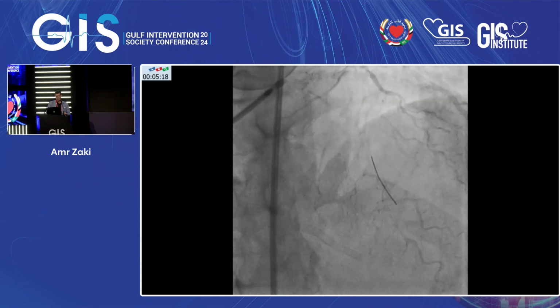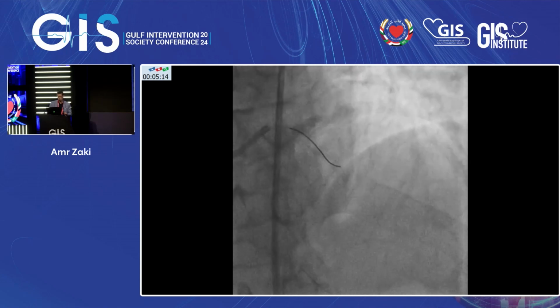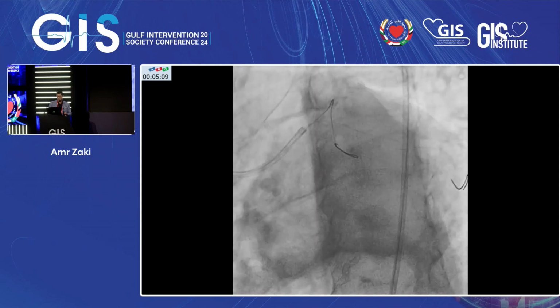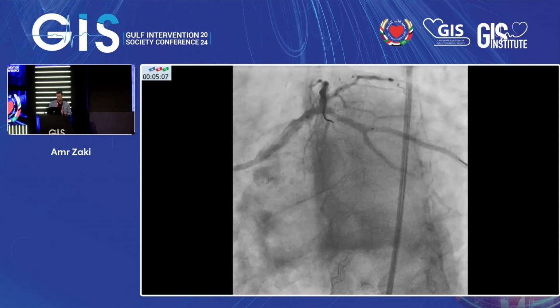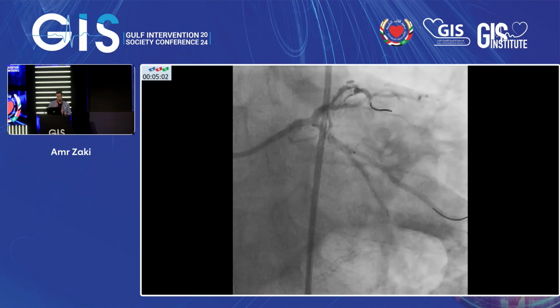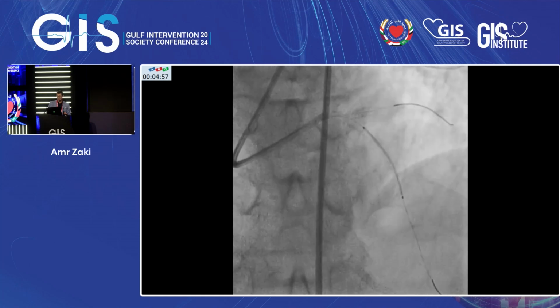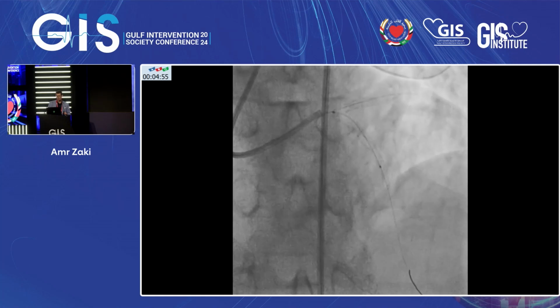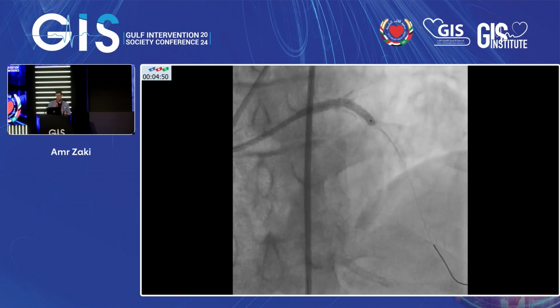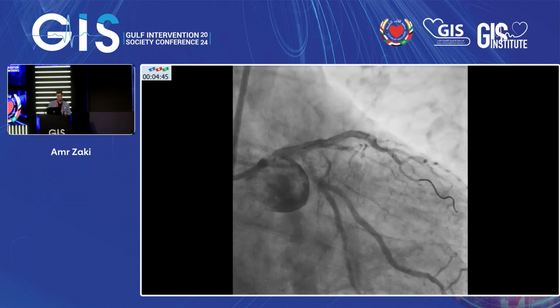Afterwards, you should have a good strategy because you're competing with surgery. Measure the length, then go and stent the LCX in a T way, because the ostium of the LCX is not so involved, so no need for DK crush here. Then going to the left main, it's 2 stents to the left main, and after kissing, this is the POT with the 4 balloon.